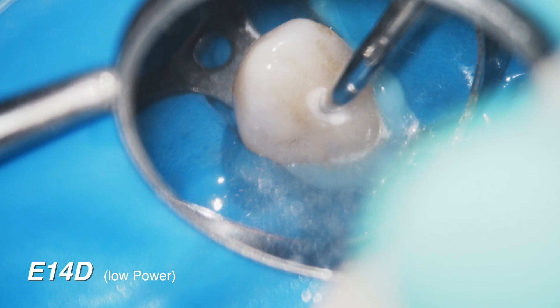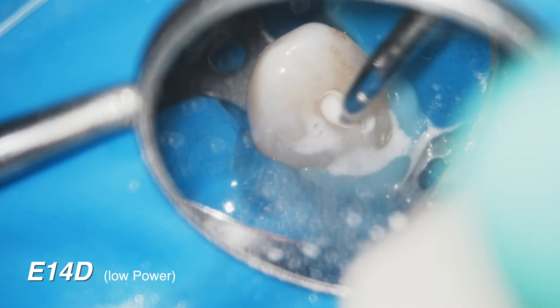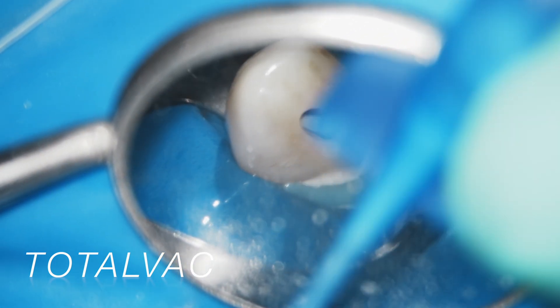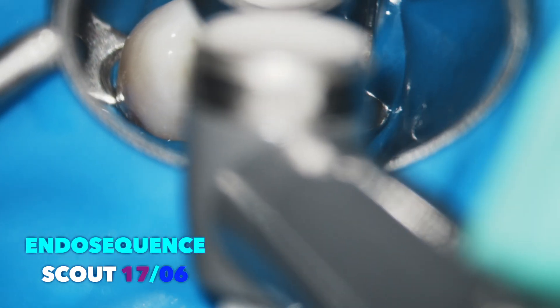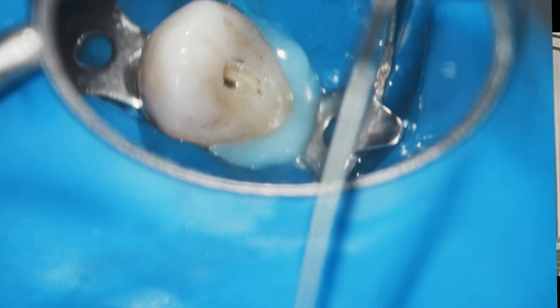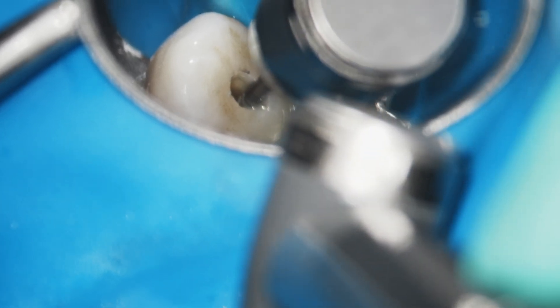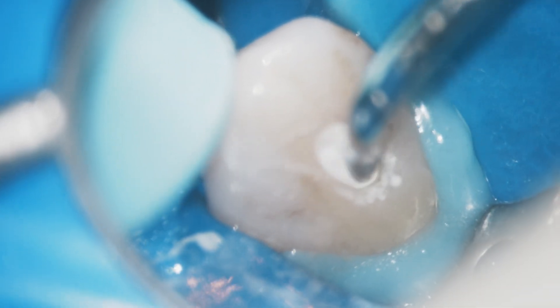This activation of the sodium hypochlorite along with the chelating and saponification agents in the Triton really loosens things up. I'm using the Total Vac again to remove the solution. Now I'm using the EndoSequence 17/06 scout to try to bypass the calcification on its distal aspect — from the CBCT, that was the only aperture and opening available. I'm being very careful not to push too hard because the opening was very small. Using the 06 taper opens it a little more, then I use the E14D in that hole to break up the calcification and remove it.